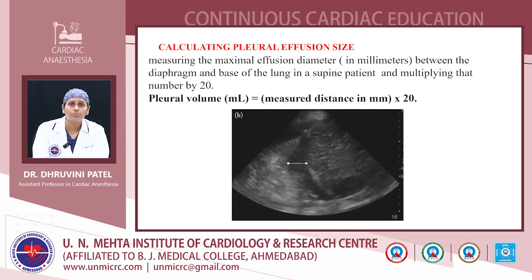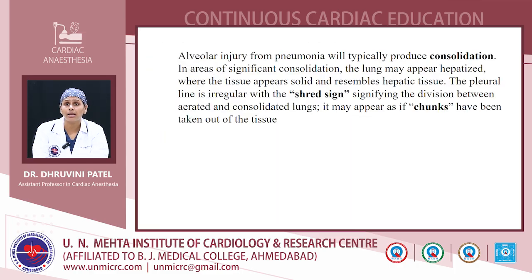How to calculate the pleural effusion size? Measure the distance in millimeters between the diaphragm and the base of the lung in supine position and multiply by 20.